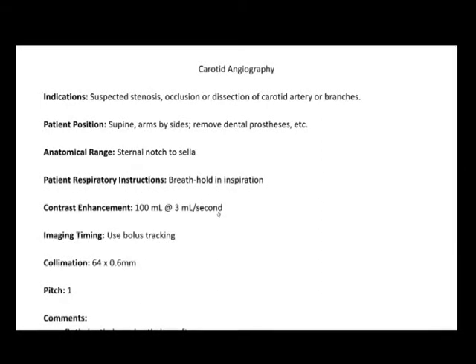We have the right pulmonary artery and left pulmonary artery. We have the superior vena cava, and it causes a scattering effect. The scanner can actually get triggered by the superior vena cava. And so typically what I like to do is put the locator inside of the left pulmonary artery, so that we are kind of removed from anything that could cause the scanner to go off without it reaching the maximum amount of density that it's required to.